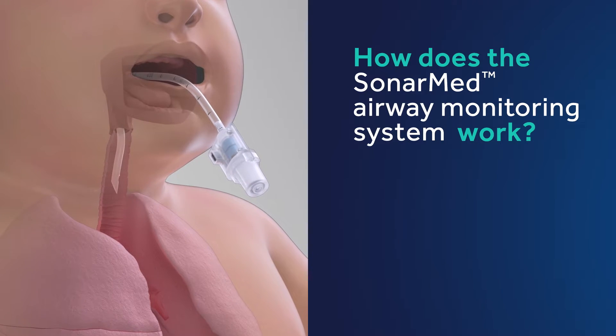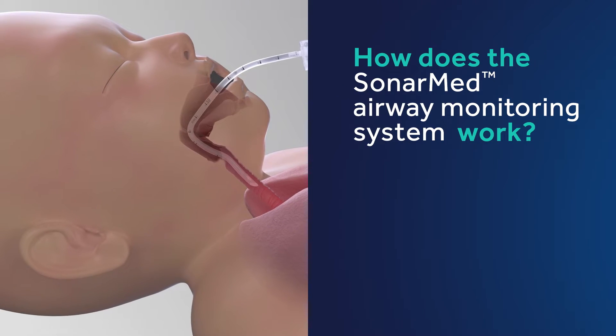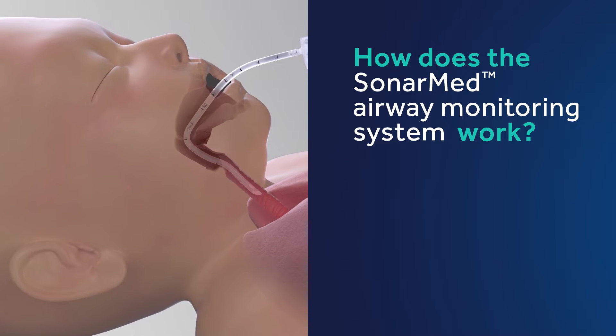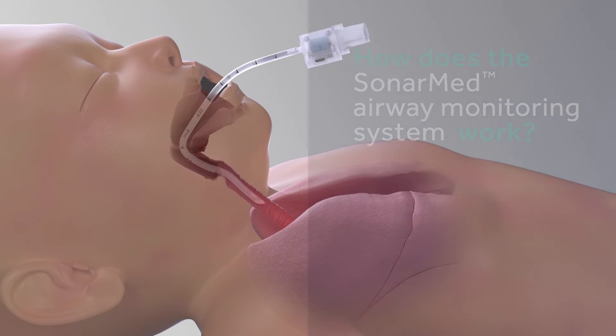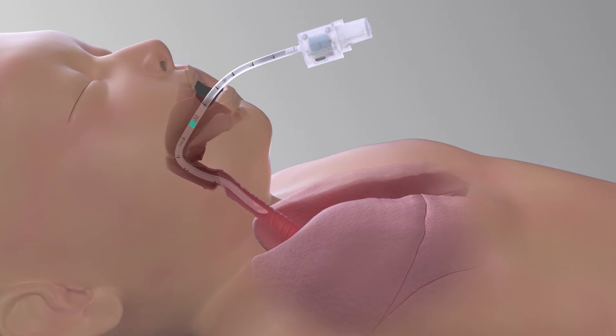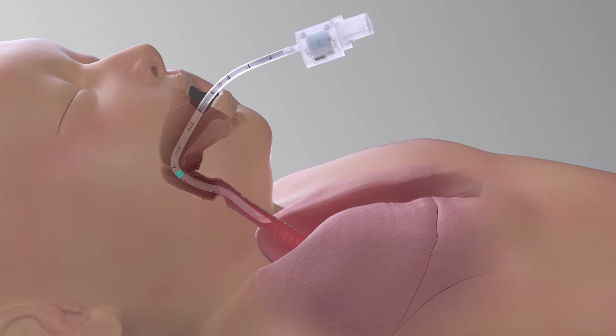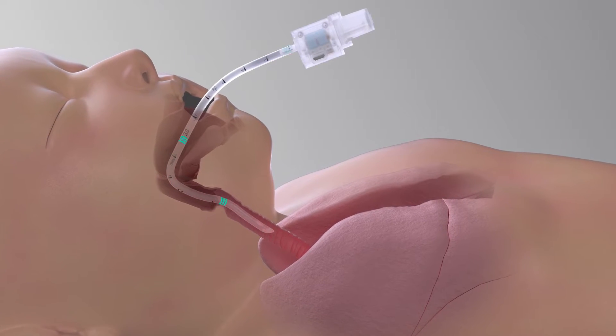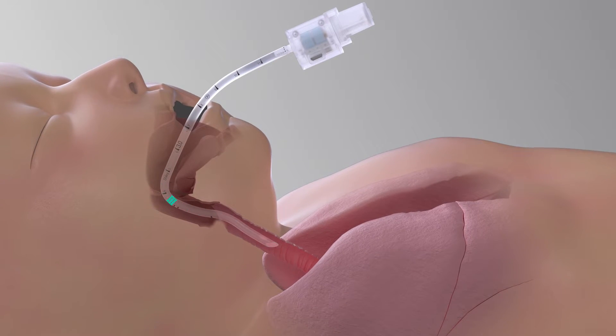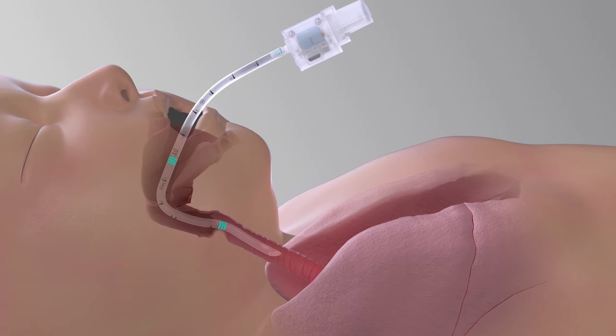This unique device uses acoustic reflectometry technology to monitor the set optimal position of the ETT in the trachea. The SonarMed Sensor emits sound waves through the tube and then measures the intensities and timing of the echoes as they return, allowing us to detect several key measures.